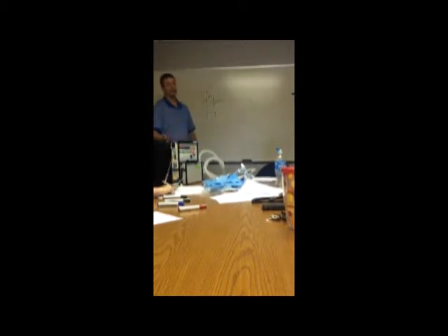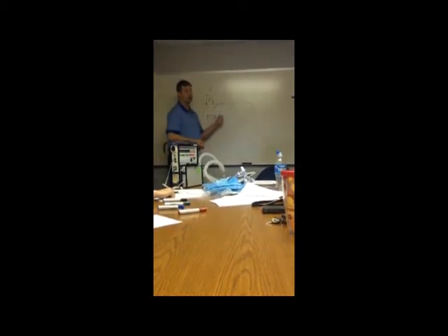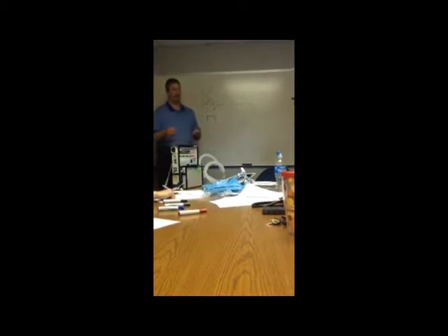okay? So that's why if you get somebody in a different mode, like IMV or pressure support or CPAP, which we'll talk about, and they're air hungry, short of breath, working too hard, the first thing I would do would be to switch them to assist control.